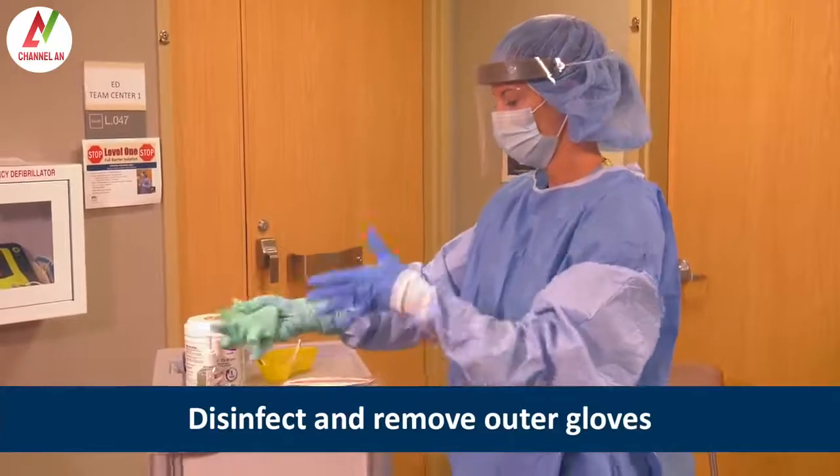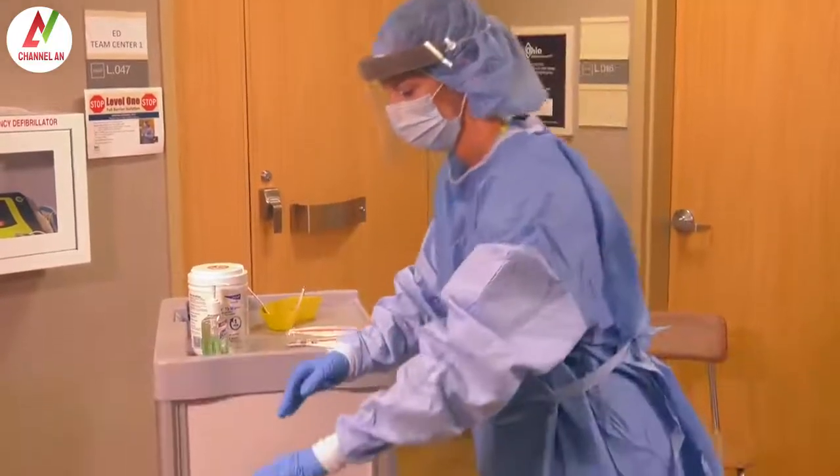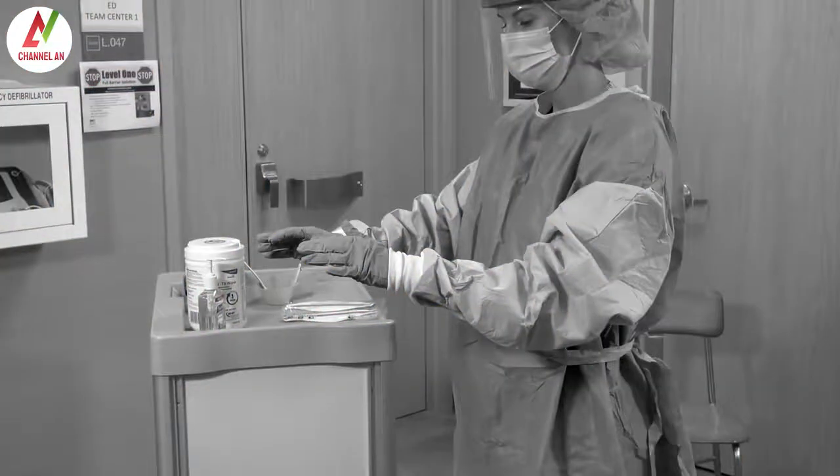Because her patient has a suspected viral hemorrhagic fever, the discarded PPE is placed into a red bag inside a leak-proof infectious waste container. If the patient has a suspected respiratory HCID like MERS, SARS, or pandemic influenza, the PPE can be placed into the regular waste stream.